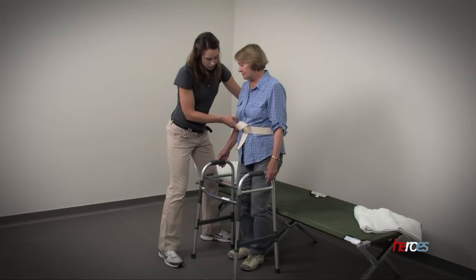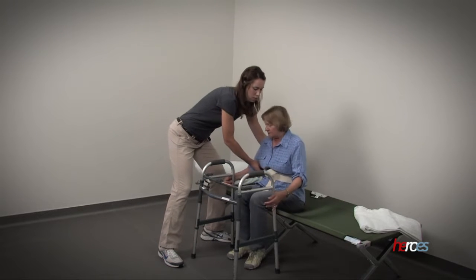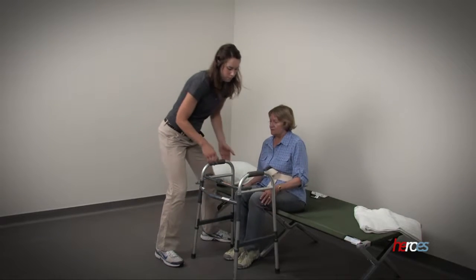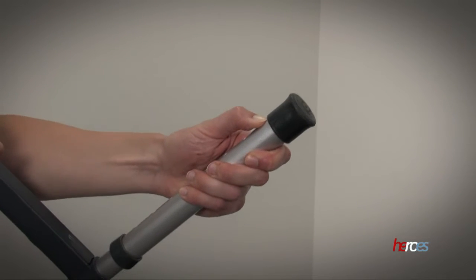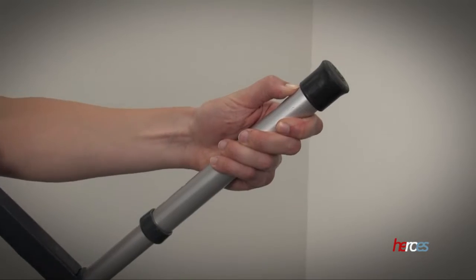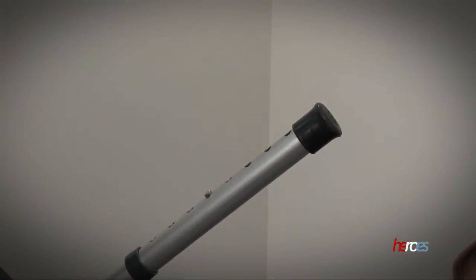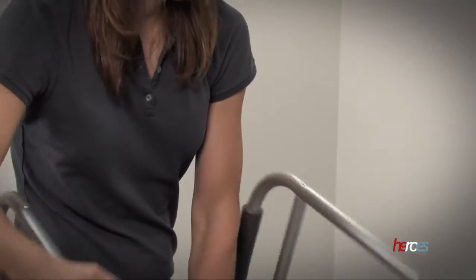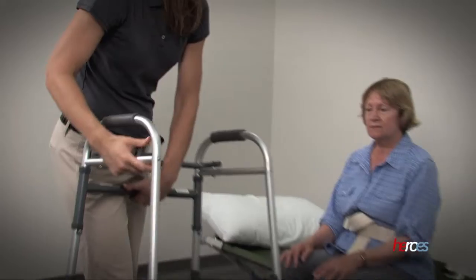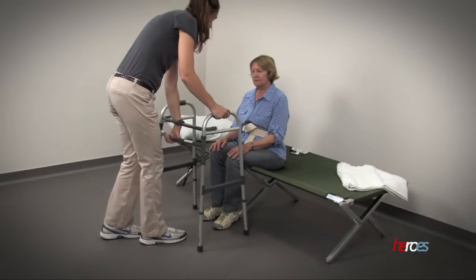If the height needs to be adjusted, have the individual sit back down. Push in the pin on each leg of the walker to lengthen or shorten as necessary. When you are finished fitting the walker, ensure that it feels comfortable.